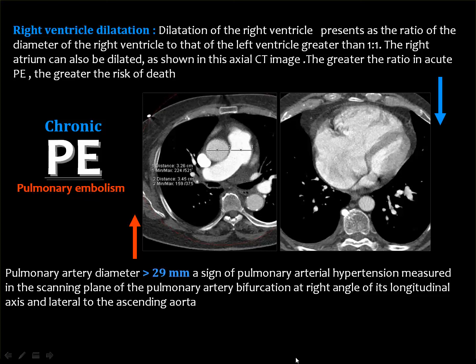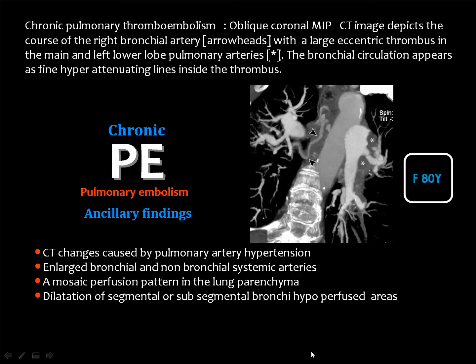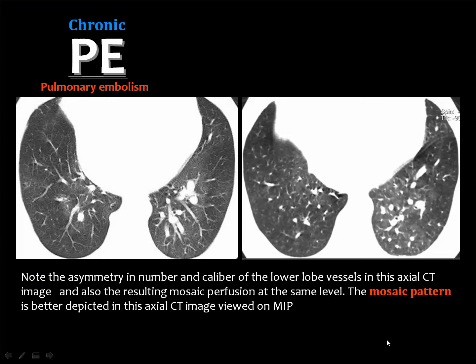Number four, thickening of the wall of the right ventricle. Number five is reflux filling of the hepatic veins as well as the IVC due to reversal of the flow secondary to increase of the pulmonary vascular pressure. Number six is the development of MAPCAs, or the major aortopulmonary collateral vessels, to compensate for the pulmonary perfusion. You see these emboli in the pulmonary artery, and these are the major collateral vessels.